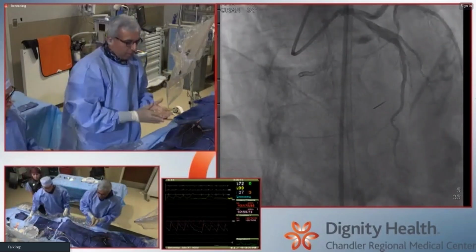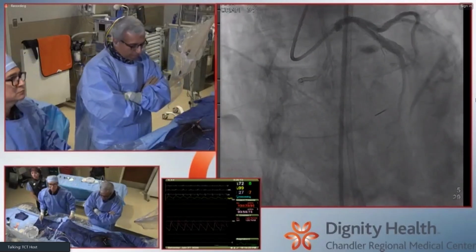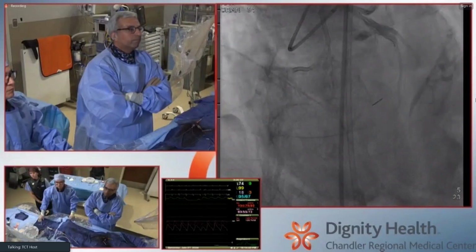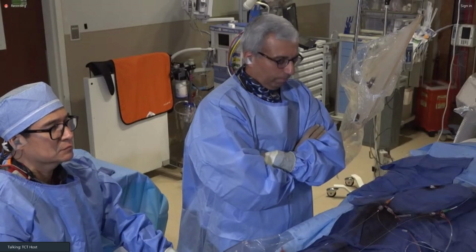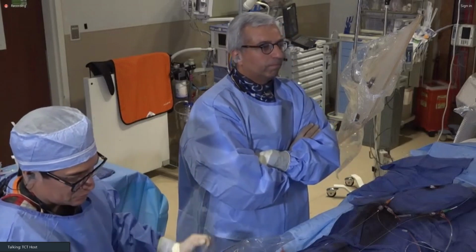You have to prepare antegrade because it's a calcific segment. It is very difficult to cross antegrade with wire escalation, de-escalation, and you have to complete by means of retrograde. So antegrade preparation and then retrograde cross is better.